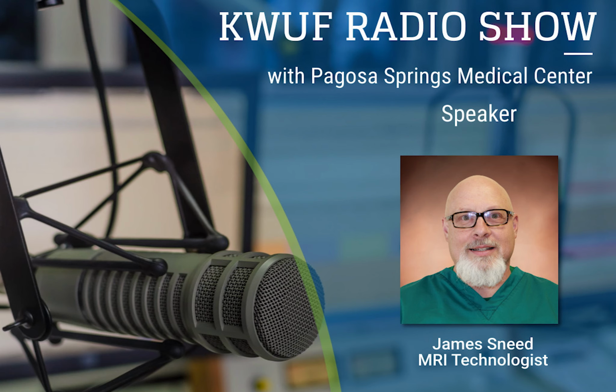Basically, don't forget the music. You could listen to KWUF or Spotify or whatever, just to relax. We do have music with a headphone set. We have earplugs. Scanners are very loud, but this one is much more mellow compared to the prior scanner. The older scanner was very loud, fairly tight, and it was a scary scanner. But the new one is not.